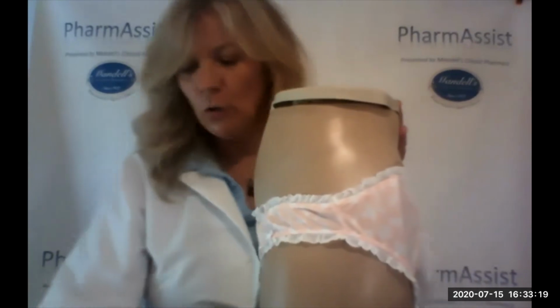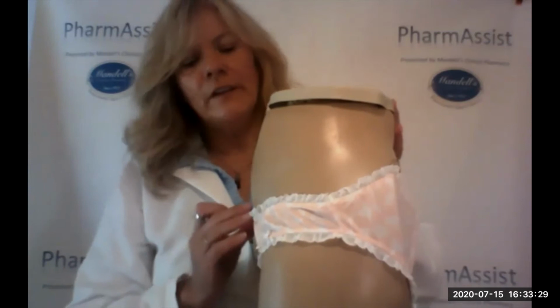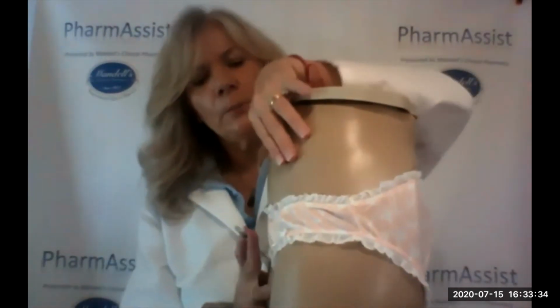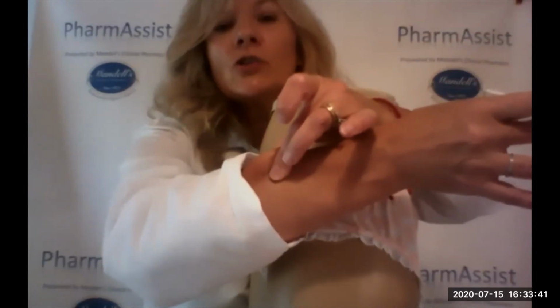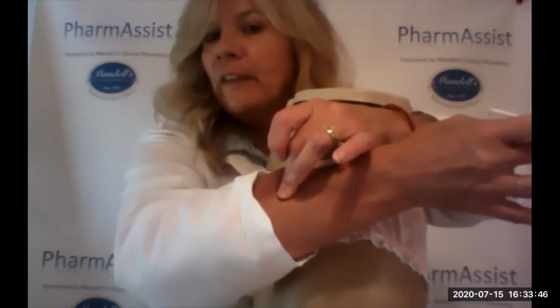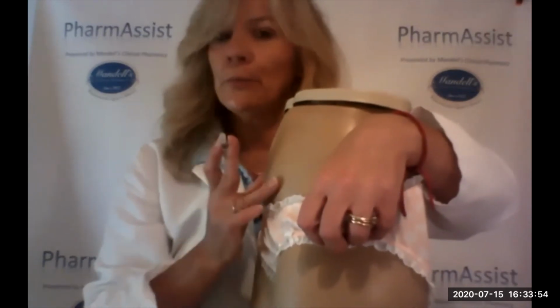So one of the things that you'll want to do is make sure that you clean the area with alcohol. One of the next steps is we uncap the needle. We give a little pinch to the skin. So what I'll show with my arm is that when you're pinching the skin, you just don't want to pinch too hard and squeeze too hard. You could get bruises. And if you get bruising, it occasionally happens to people when they get blood drawn or shots given. It's a-okay. You just want to make sure you don't administer another shot in a bruise. If you get a bruise, let it heal.